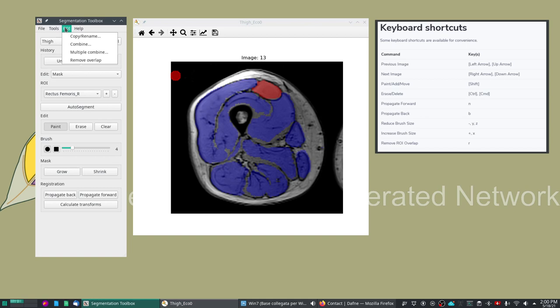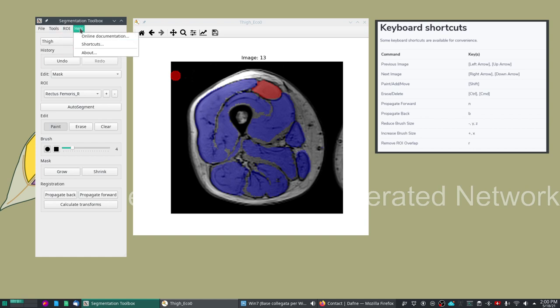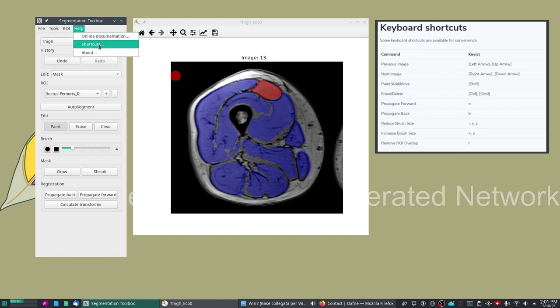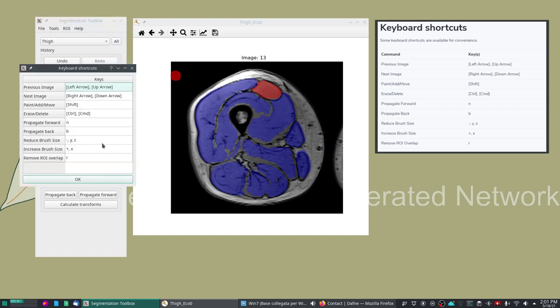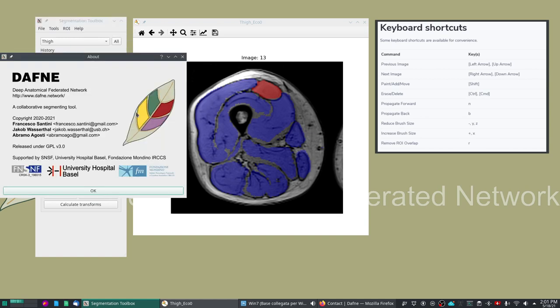You can remove overlap. In the ROI menu you have the possibility of doing boolean operations on ROI or copying and renaming ROIs. The help has access to the online documentation, it's just a link to the Daphne site. It has a reminder of the shortcuts which is the same as is displayed here, and finally just an about that contains our emails and some information of our funding and our institutions.